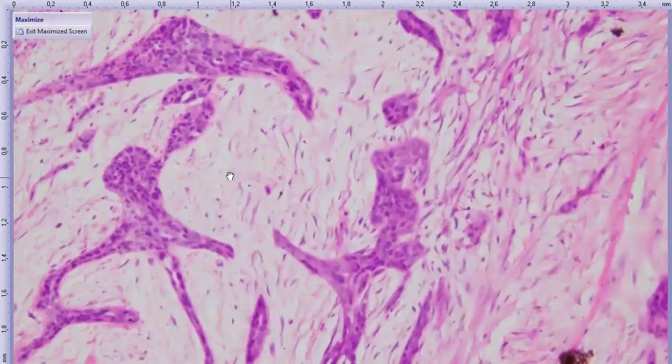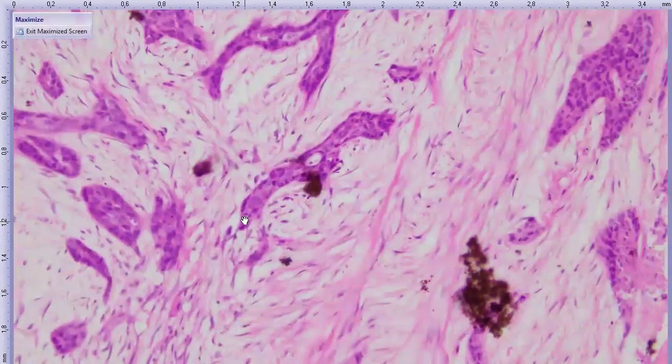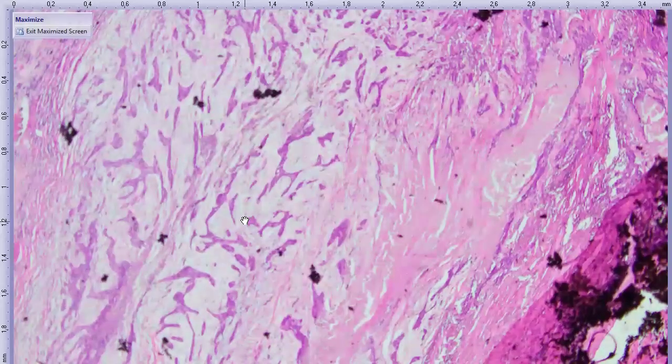So they stimulate the stroma to proliferate around and form this kind of supporting stroma. So desmoplastic or scirrhous response, right? Which I think probably is one of the reasons why we saw that very thick and white infiltrate on low magnification.